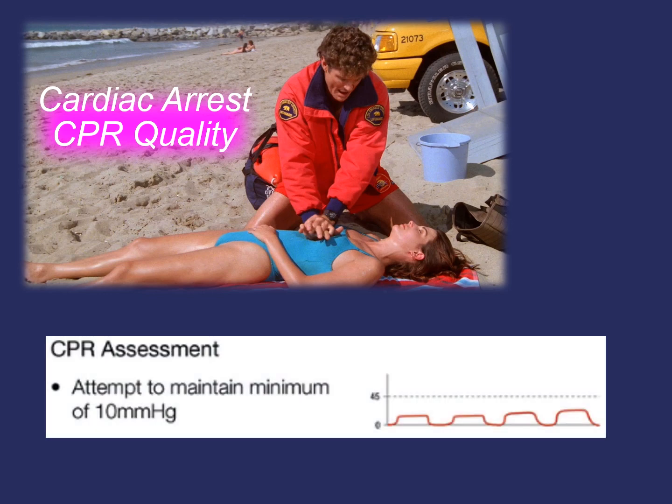We can combine the end tidal CO2 to measure how the body is responding to CPR. Values of 10 millimeters of mercury and greater indicate that there is perfusion with chest compressions. We may also notice that there are waveforms present to correlate with chest compressions, and this is an indication of passive air exchange between ventilations. Another positive feedback for the compression rate. Values are going to vary from patient to patient. The main goal during resuscitation is to maintain an end-tidal CO2 minimum of 10.